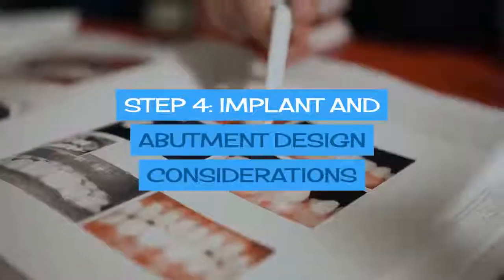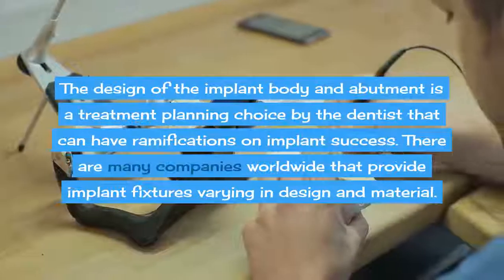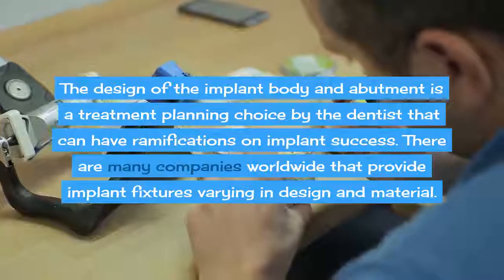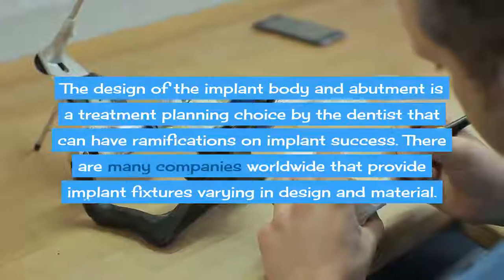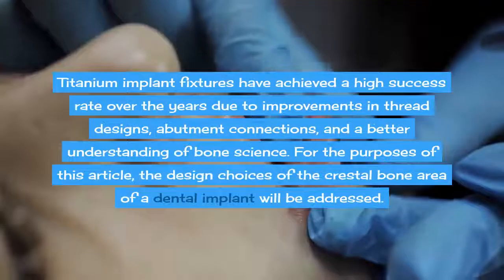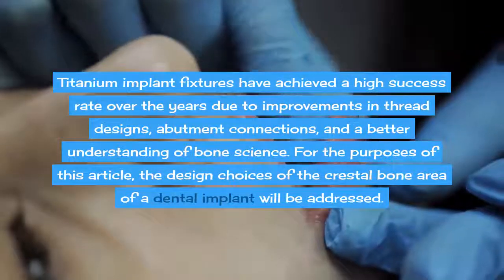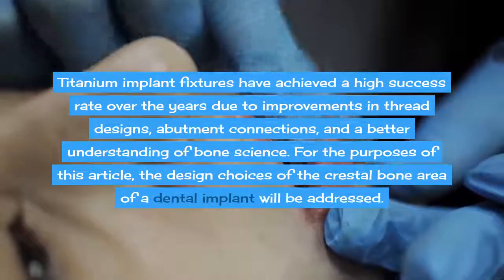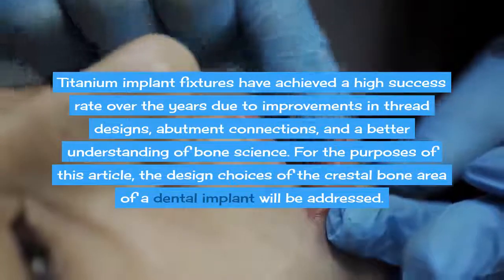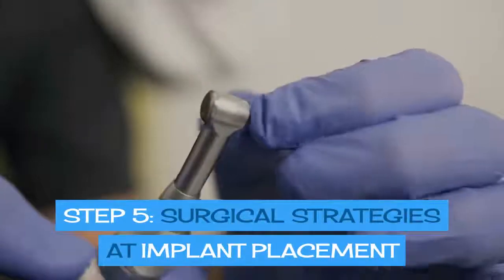Step 4. Implant and abutment design considerations. The design of the implant body and abutment is a treatment planning choice by the dentist that can have ramifications on implant success. There are many companies worldwide that provide implant fixtures varying in design and material. Titanium implant fixtures have achieved a high success rate over the years due to improvements in thread designs, abutment connections, and a better understanding of bone science. For the purposes of this article, the design choices of the crestal bone area of a dental implant will be addressed.